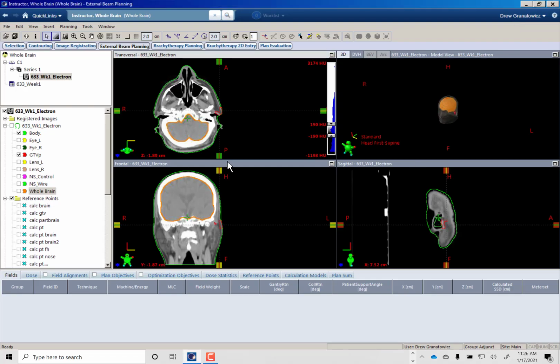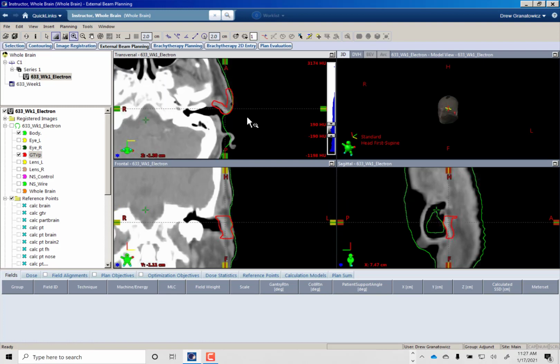Okay, let's get into treatment planning. So I'm going to show you one plan, and then I'm going to have you do 2 plans, which we'll go over soon. But we're going to assume for this first plan that our physician gave us this GTV, and that's it. So it's up to us to pick our beam, our block, our energy, all of that. So how are we going to do this? Just immediately looking at this, we can see that there's a few problems.